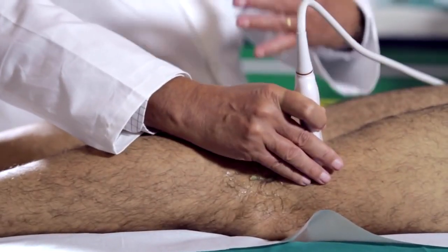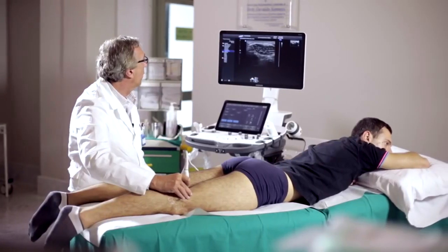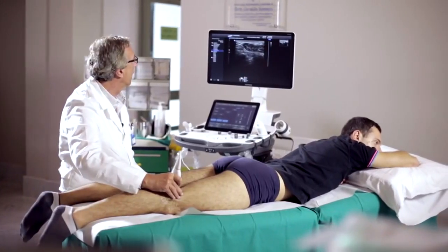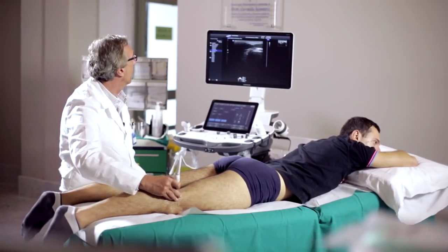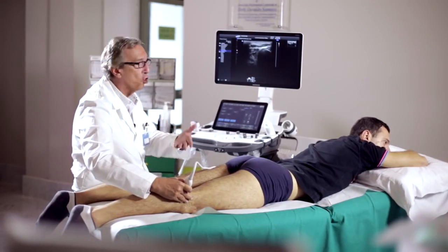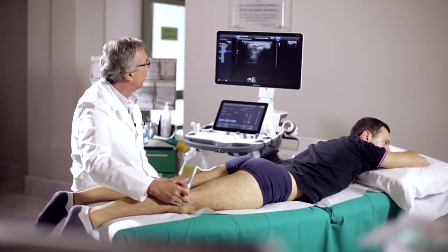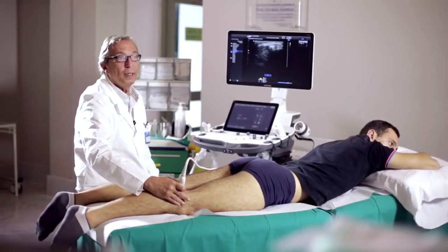The scanning is done using a posterolateral approach, and we see how the probe has to be positioned to assess its presence and to follow it to the point where it leads above the head of the fibula and finally rotates anteriorly. With this scan, the ultrasound examination of the knee is complete.